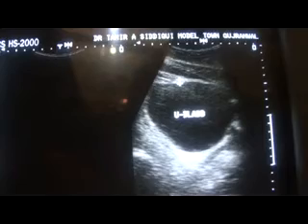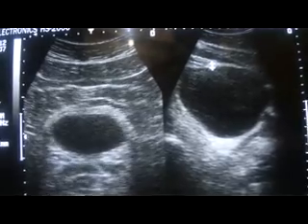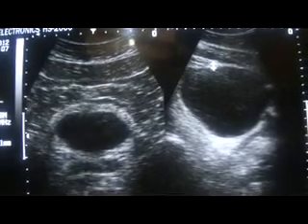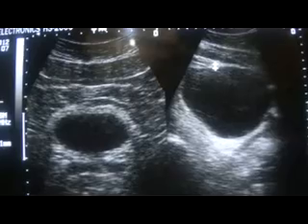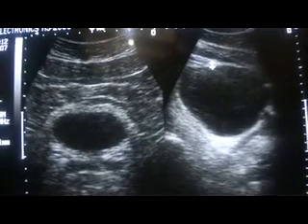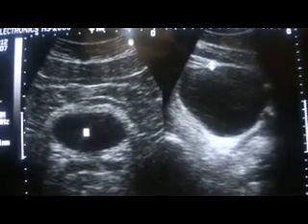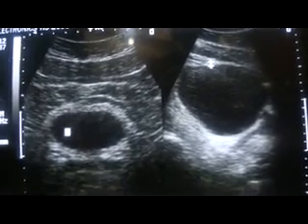So always try to perform ultrasound with a full urinary bladder. If the patient walks in and you immediately perform the ultrasound and see thick walls of the urinary bladder, ask the patient to hold the urine. You will then see the difference — the wall is absolutely thin with a full bladder, whereas it appeared thick, giving a false impression of cystitis. That is a wrong impression. If with a full urinary bladder you see thickening of the anterior or urinary bladder wall, then you can label it as cystitis.